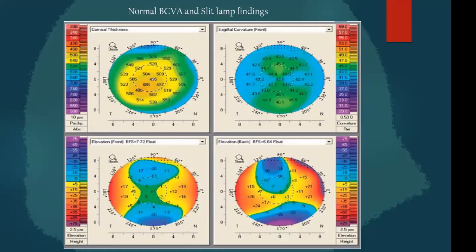Yeah, so let's make it more interactive so that I also know what y'all have understood and what y'all want to know more. I have a lot of images. So accordingly, would somebody like to tell, or should I? No, the central cornea thickness is reduced. Yeah, correct. What else? That's great. You have recognized this point of corneal thinning where the cornea is around 480. All right, great. And something else?